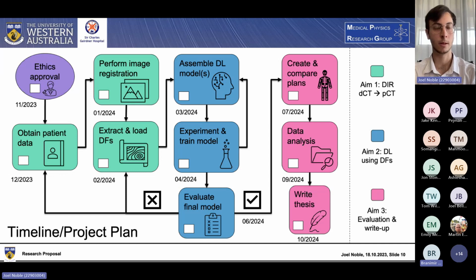Yeah. And lastly, if the model is somewhat workable but not exact, and there are issues with drastic weight loss or changes in the internal anatomy that are random and can't be predicted, then what could be done is that these synthetic CTs could be used as a baseline non-clinical plan, which can then be used subsequently to expedite the real plan once the patient gets their simulation CT, because you already have that baseline plan to initialize and start with.